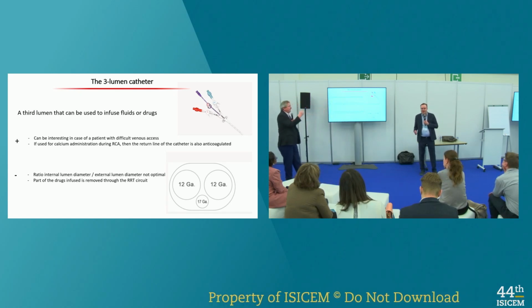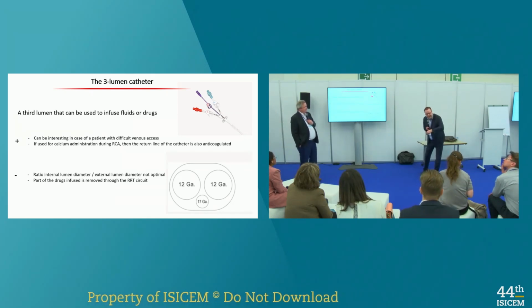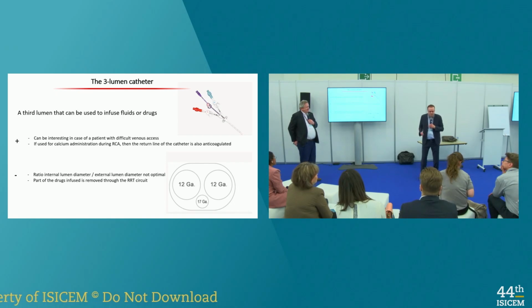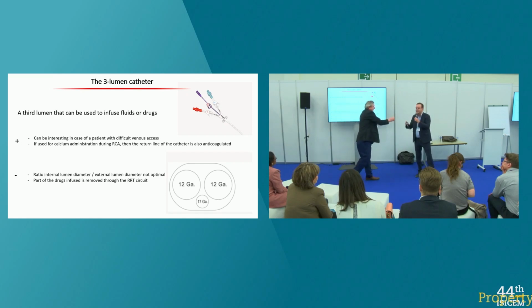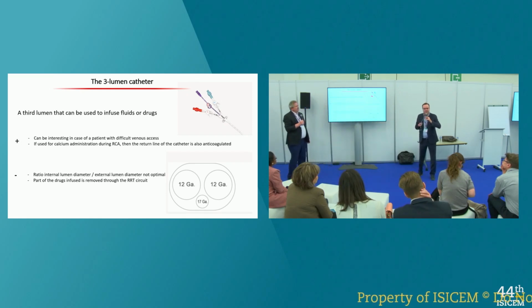Yeah, because why do people place the catheter at the entrance and not inside the right atrium? What's the risk? In the past, the theoretical risk is that the atrium is hitting the tip of the catheter, and then there will be rupture of the wall of the right atrium, right? Imagine your atrium hitting the wall like this with the tip.